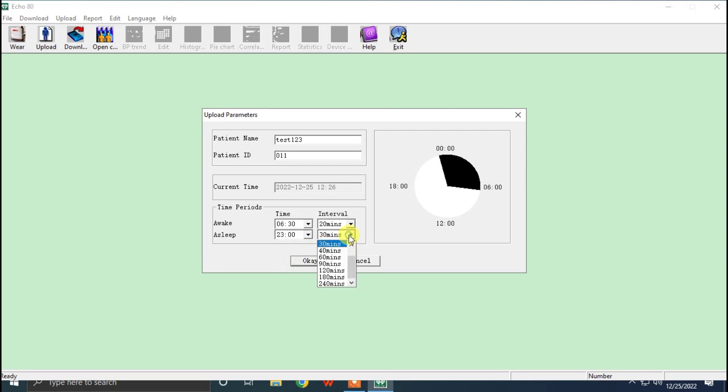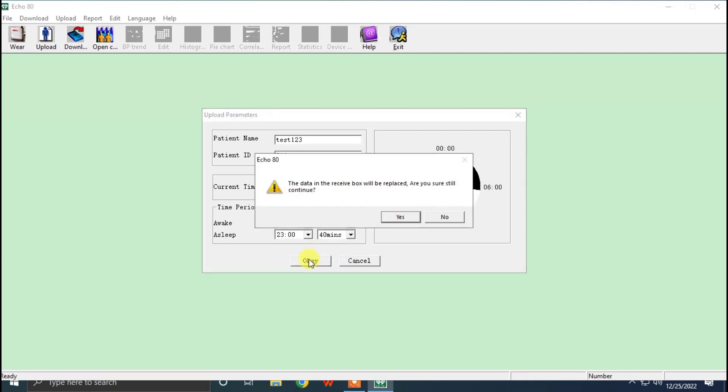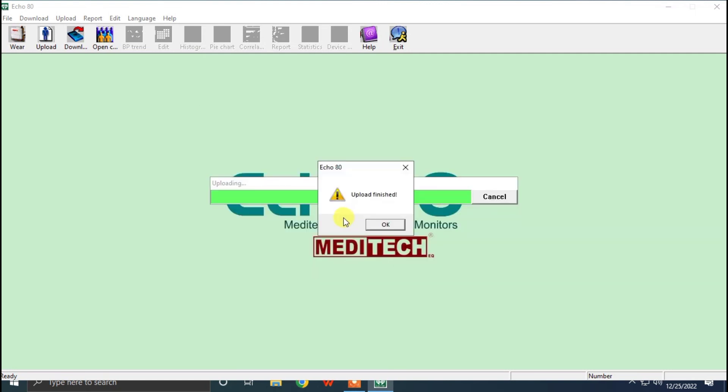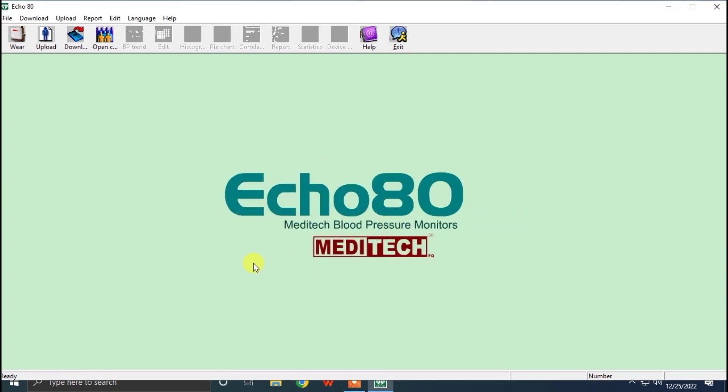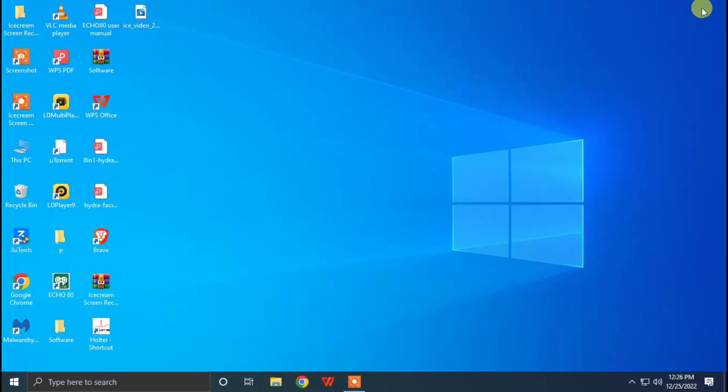After that, we can click OK. Now the system is ready, and we can put the system to the patient and send to home.